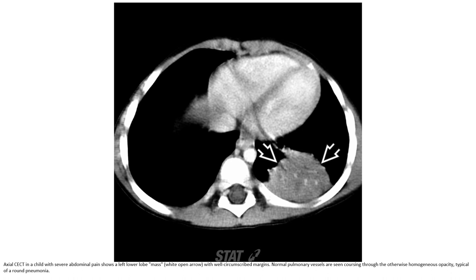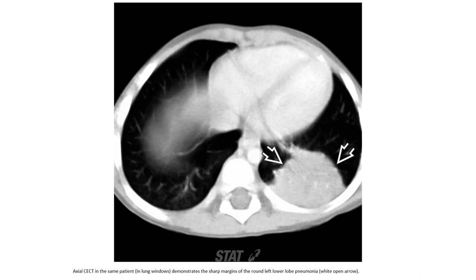Contrast-enhanced CT in a child with severe abdominal pain demonstrates a left lower lobe mass, as indicated by the open arrow, with well-circumscribed margins. Normal pulmonary vessels are seen coursing through the homogeneous opacity, typical of a round pneumonia. The axial non-contrast CT in the same patient in the lung window demonstrates the sharp margins of the round left lower lobe pneumonia.